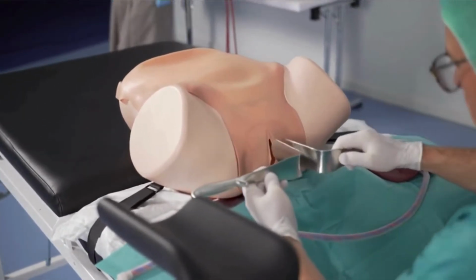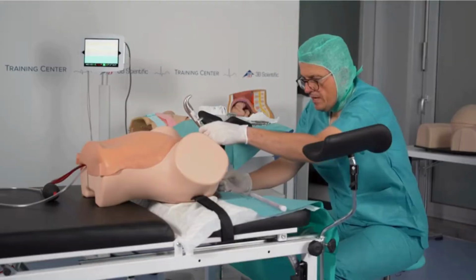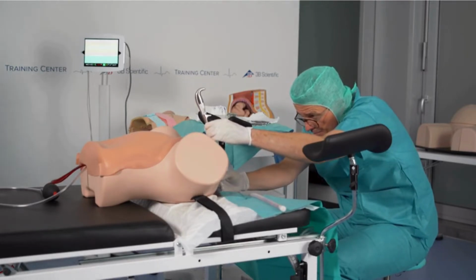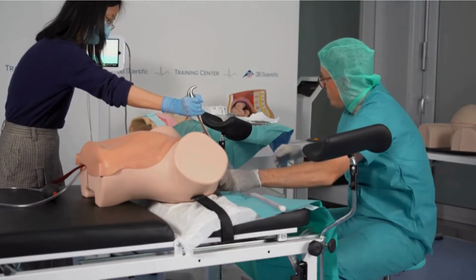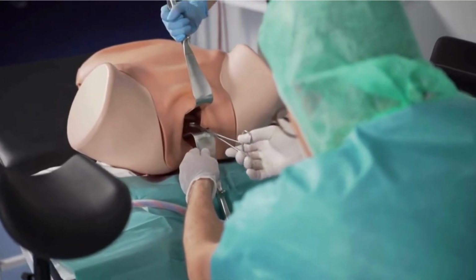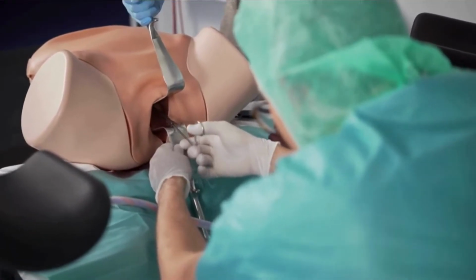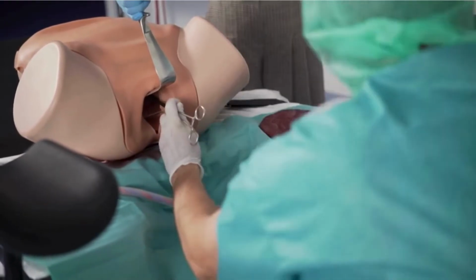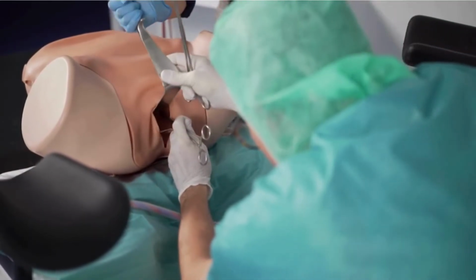So what I can do in this simulation, I can do a speculum, and now I need somebody to hold it here, please. And you can already see here the cervical os widely opened, as it looks in a woman that has just delivered. And you can take the cervical os with a clamp, and you can take it out, please. Just put it here.